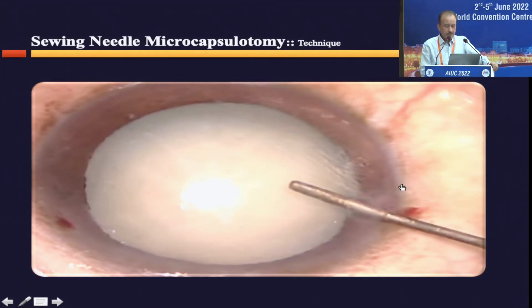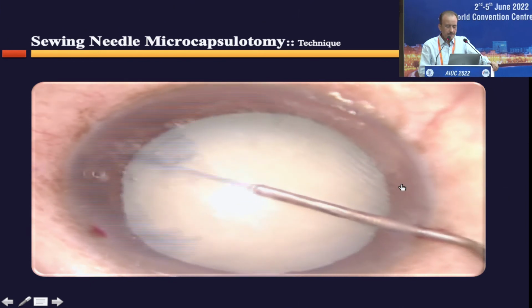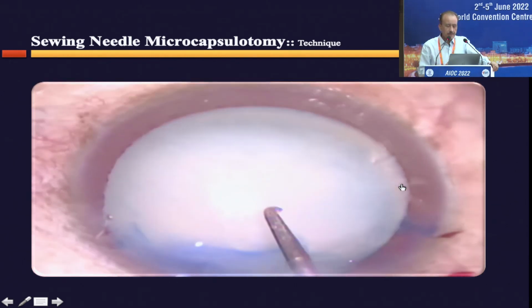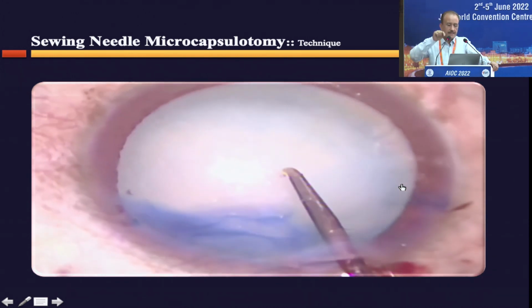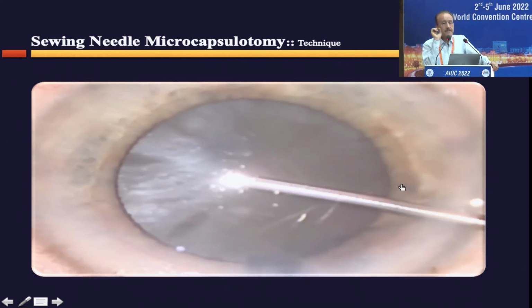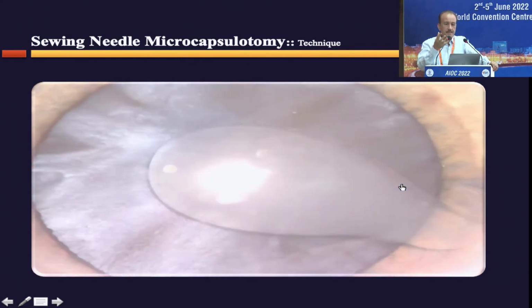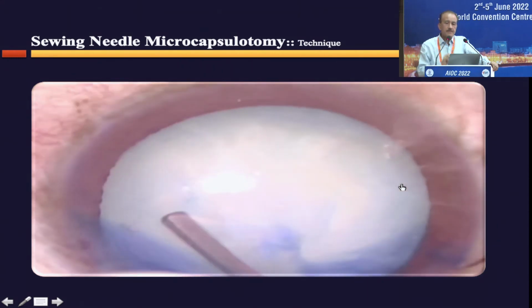And this is the video you can see here. Just the last one or two slides only. Always stain the anterior capsule. Always pressurize the anterior chamber with a good viscoelastic. And this device has to be kept vertically; it has to puncture vertically. It should have a sharp tip, so that is very important. Don't use a blunt tip. If you hit the anterior capsule with a blunt tip, then the capsule will disrupt. Instead of having a puncture, you will have a disruption. So it has to be a sharp pointed tip, then only it will work.